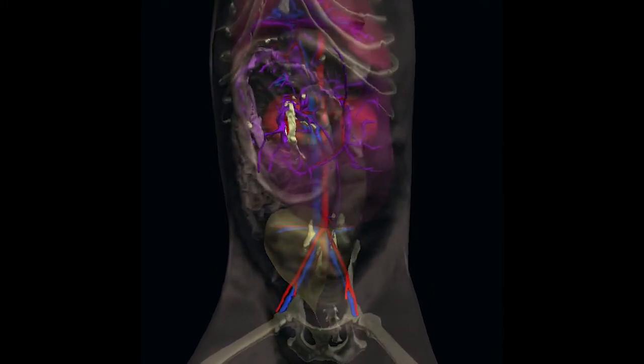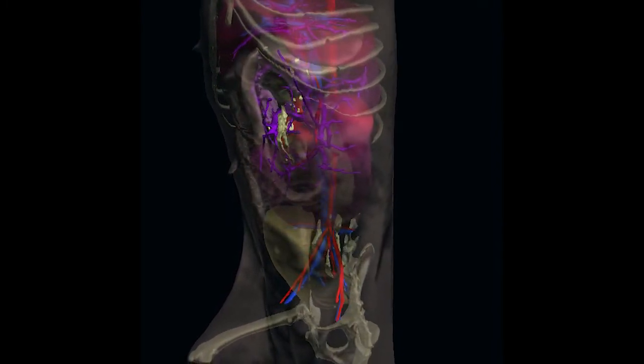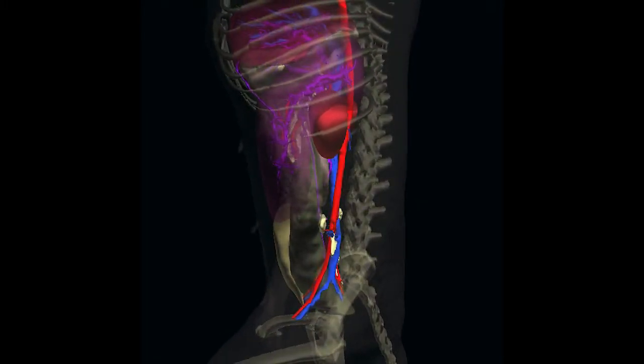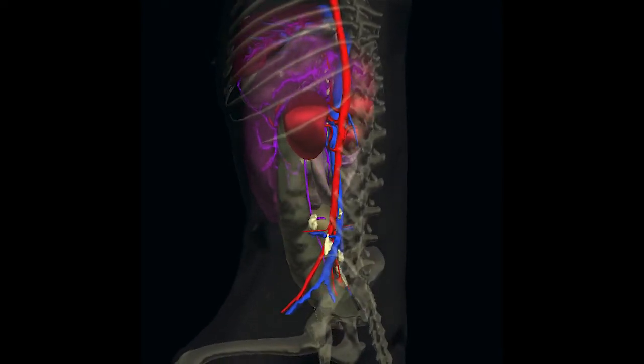The abdominal cavity has many lymph nodes. These nodes, beige colored in this animation, are mainly located close to vessels that can be identified with ultrasound. In fact, these vessels represent significant anatomical landmarks for locating these nodes.